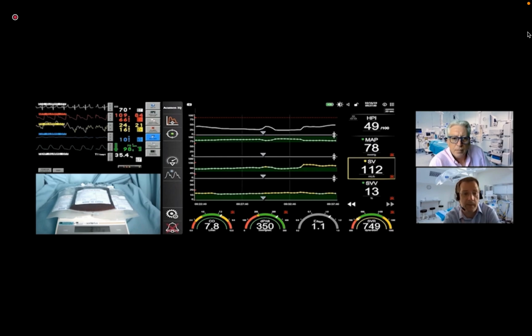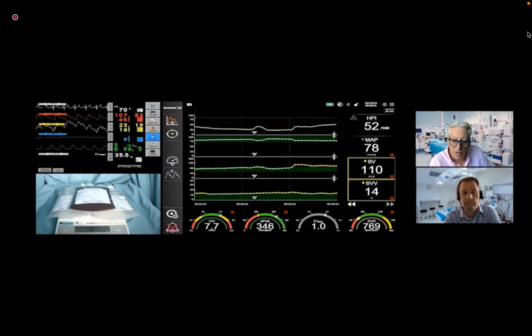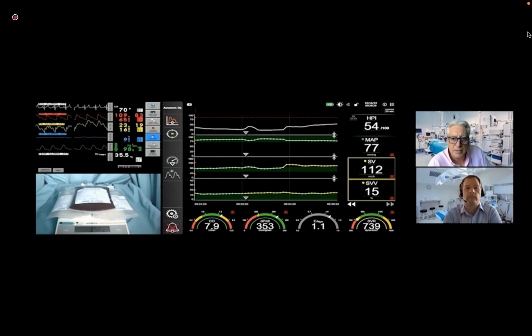We frequently have to rob Peter to pay Paul. We know we can donate a unit of blood. Not everyone tolerates that well, but most recurrent donors tolerate it very well. In order to be able to stand up after blood donation, you have to have compromised some blood supply somewhere to maintain central blood volume. That's autonomically controlled, so that's probably why HPI has shot up now. It's probably telling us things that are happening, as you described earlier, that the human eye can't detect, because I must admit there's nothing I can see on the high-end monitor that would tell me there's 250 mils of blood in the bucket.